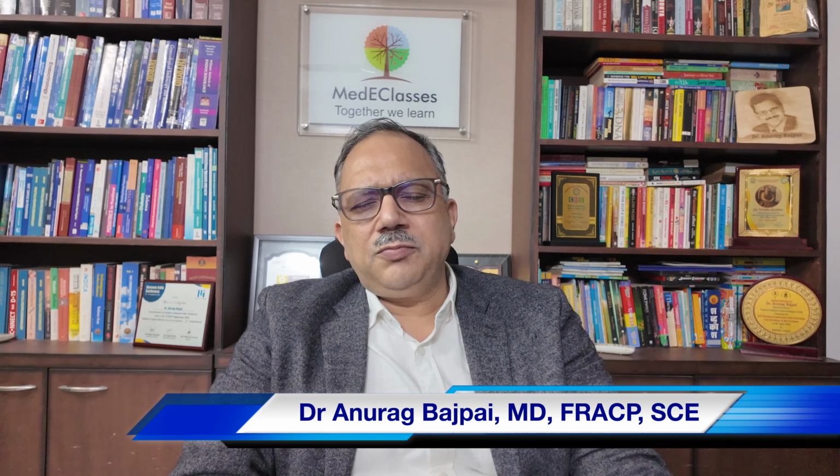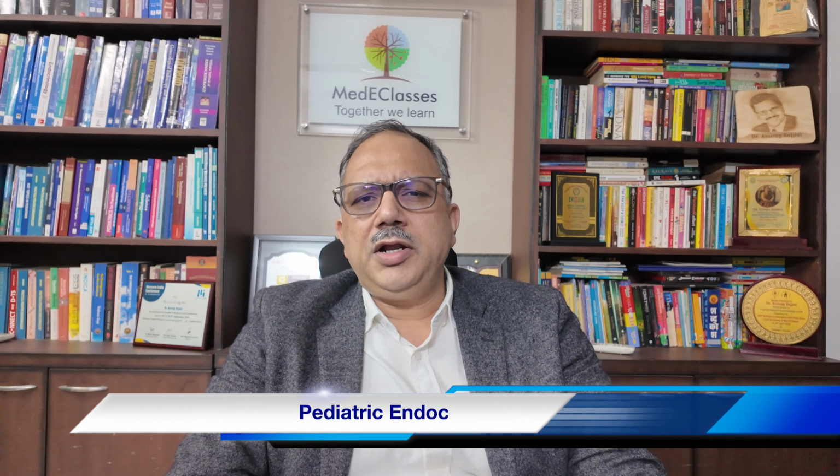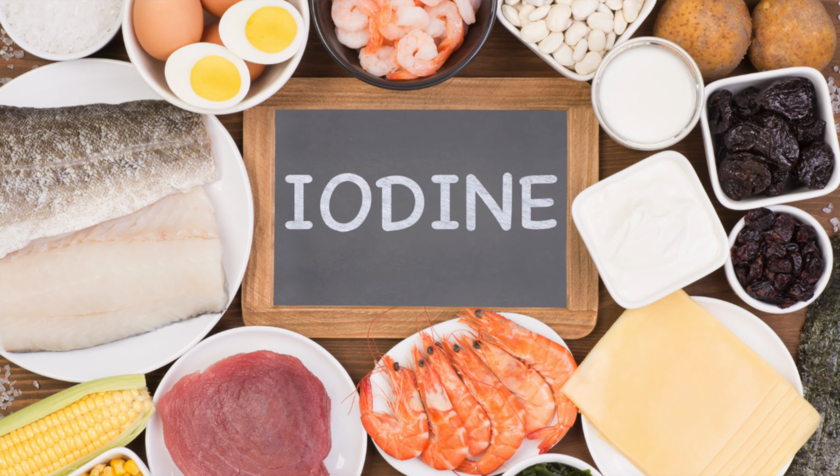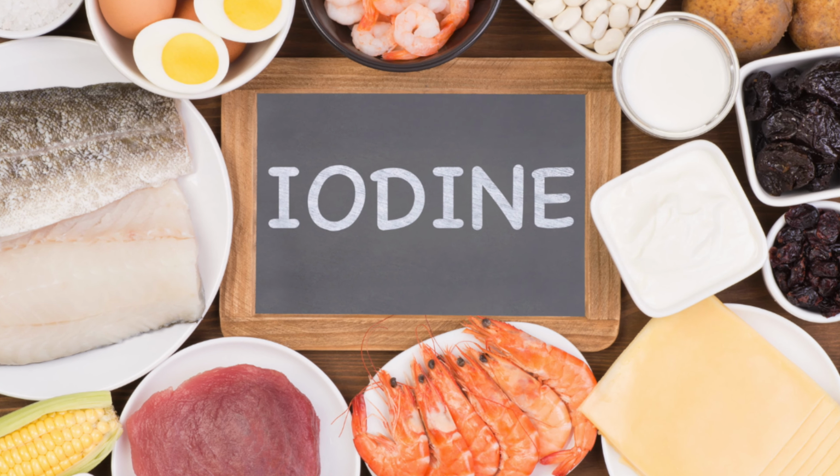Thyroid nuclear scans play a very important role in evaluating a number of thyroid disorders. The thyroid gland is essentially an iodine concentrator. It takes up the iodine in the gland and converts it into the thyroid hormones T3 and T4.